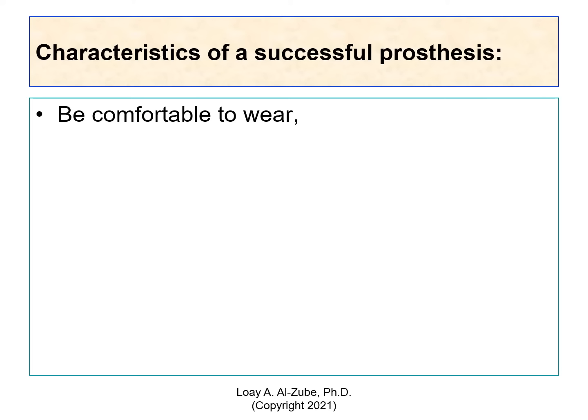Okay, how do you characterize success? And here, I want you to think about what we can do as engineers. What are the things that we can do to help achieve a successful prosthetic? Comfortable to wear. How would you characterize and assess comfort?